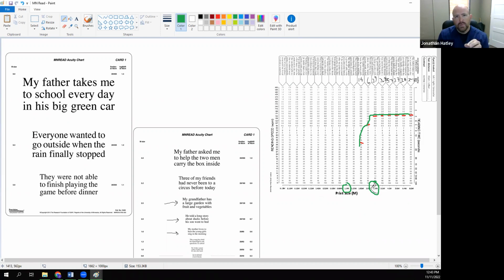Now, the reason that it's very important for us to know the test distance is because that's going to influence our calculations for what kind of add the patient is going to use. There are multiple methods in order for us to determine the add power that we need for the patient to see 1 M. The easiest one that I like to use is just to invert the visual acuity fraction. So sort of like with Colenbrander, if the patient was at 40 centimeters, you could record this as 0.40 over 2.5 M. So that would be their reading acuity with this particular test.